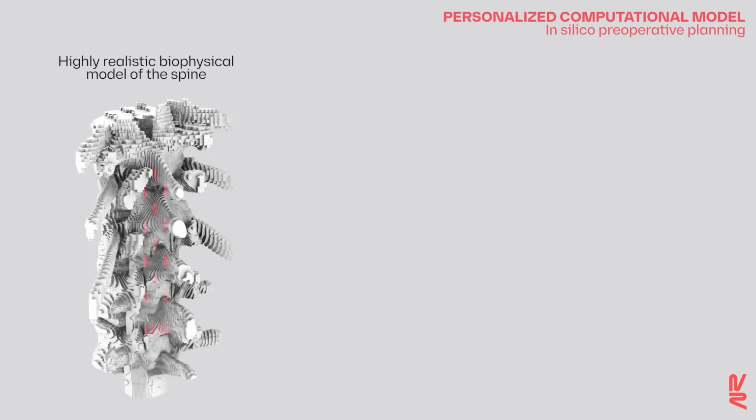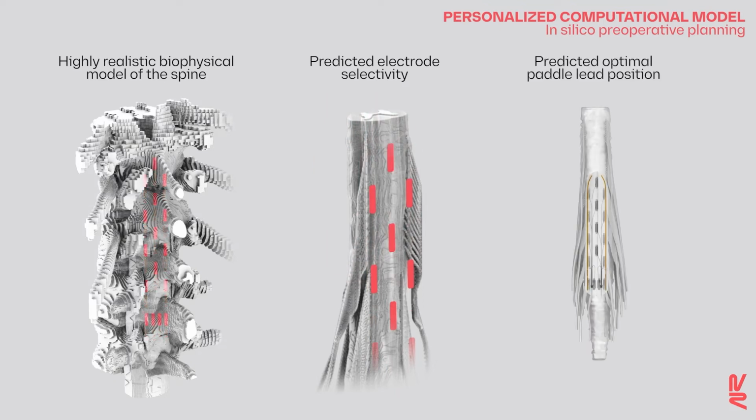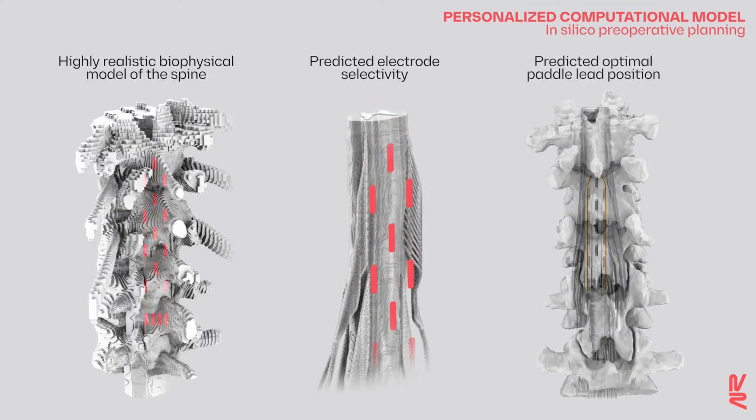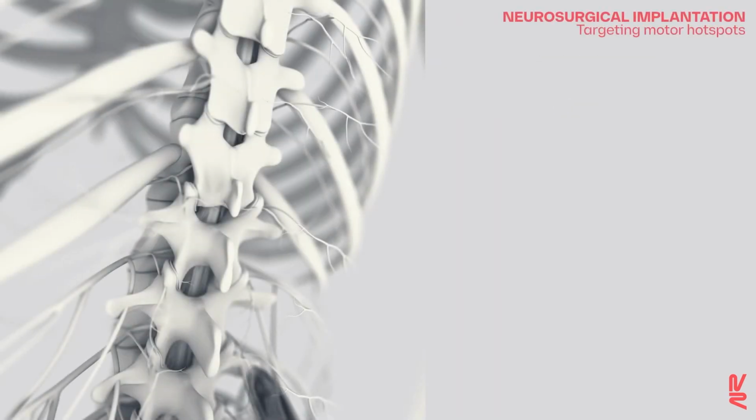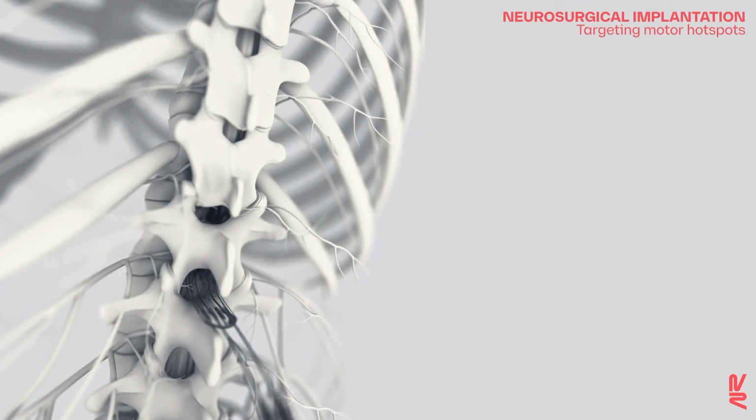These anatomical and functional features enable the personalization of the computational model. Simulations identify the optimal position of the lead to recruit the targeted dorsal roots. This preoperative planning procedure guides the neurosurgical implantation of the paddle lead.